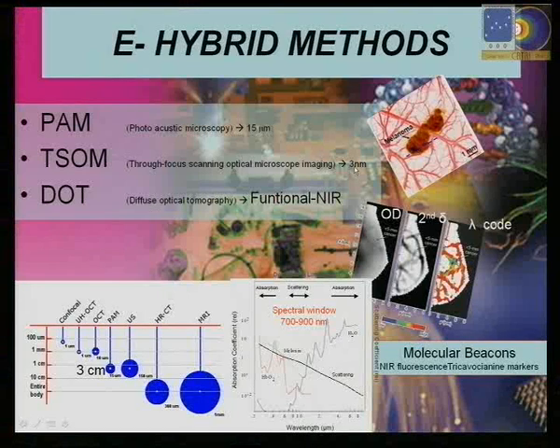localization. So you take several images on different Z localization, and you make the difference between those images. And this difference will allow you to get 3 nanometers differences. So you can detect things which are very, very small.